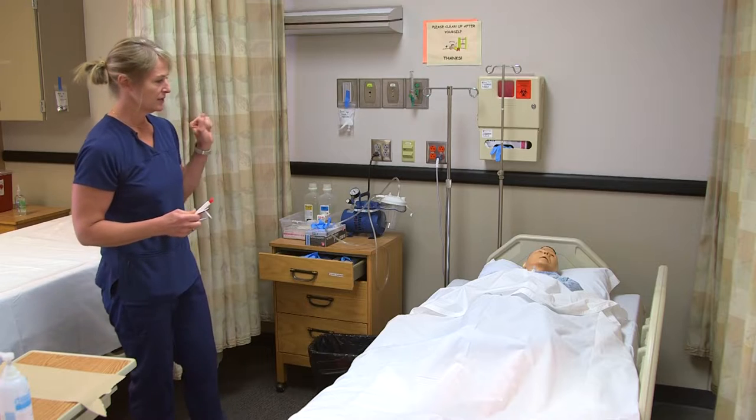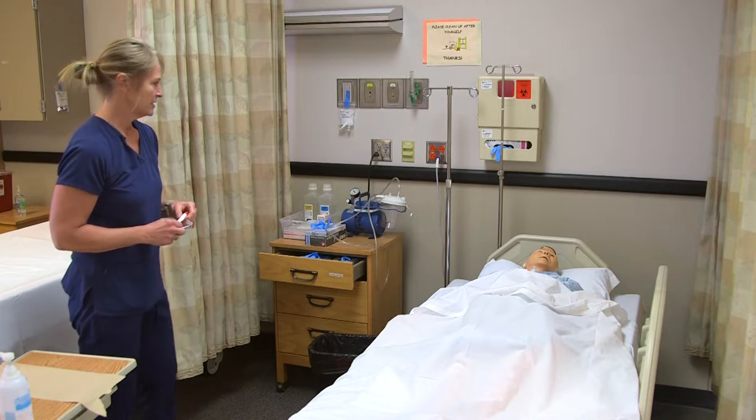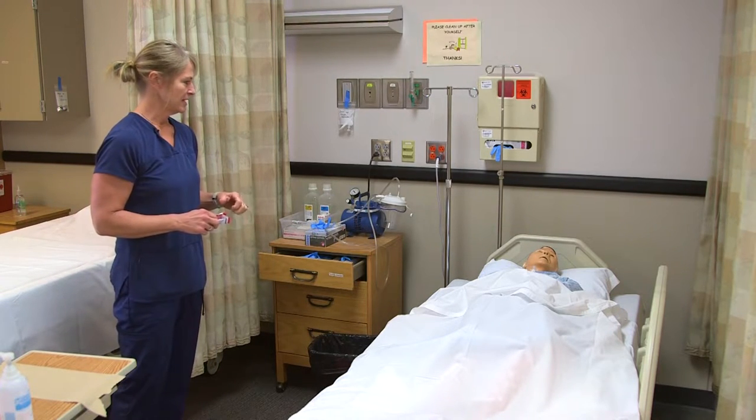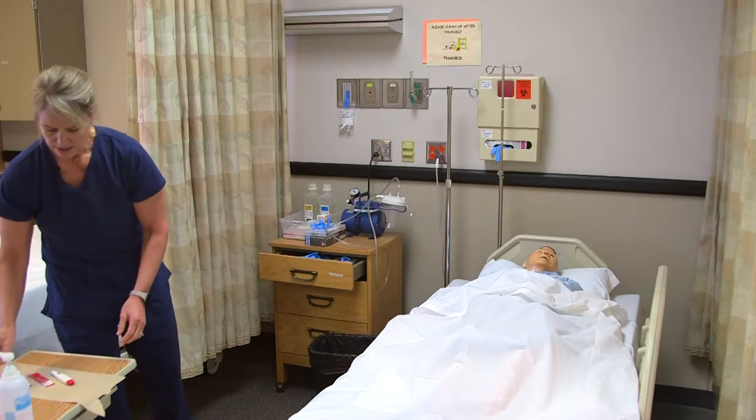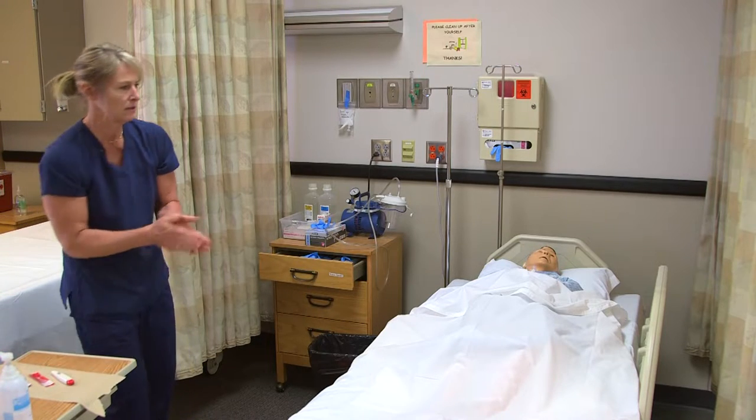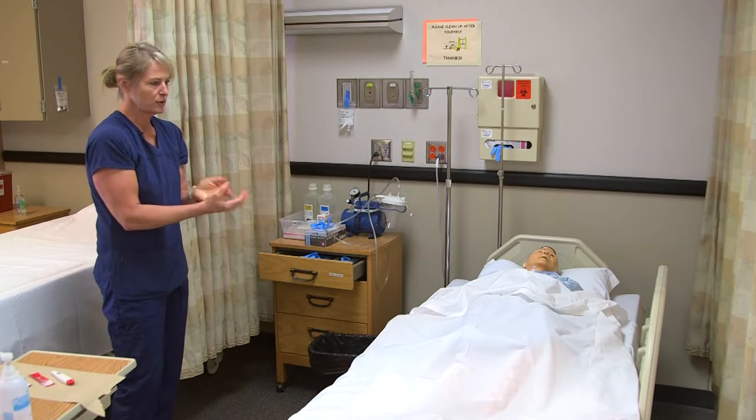Those are my supplies. I would knock on the door: 'Hi Lee, I'm here to take your temperature. I'm Myra, your CNA. Is that okay?' I'm going to put the thermometer down on a barrier, wash my hands, and make sure that curtain is pulled.